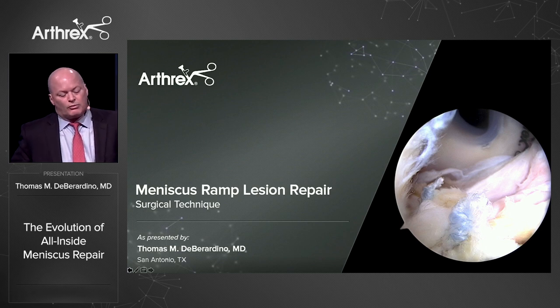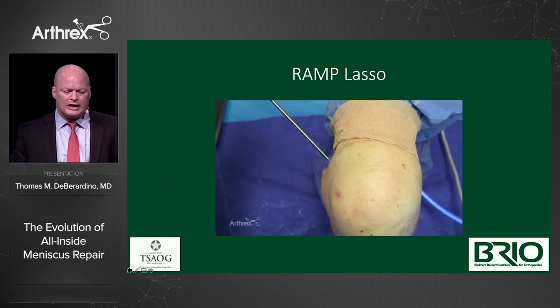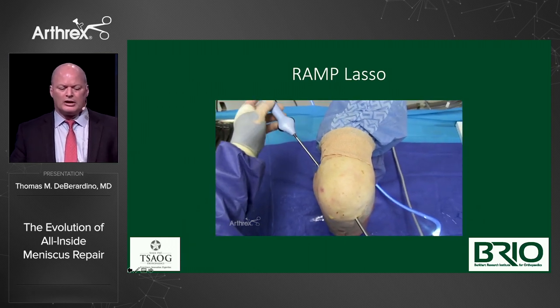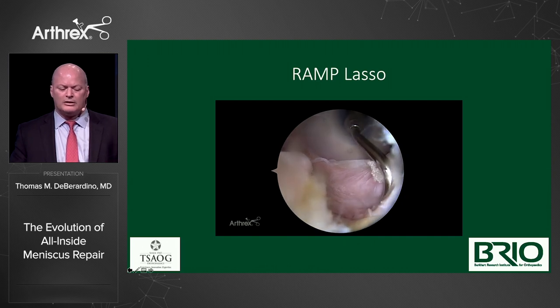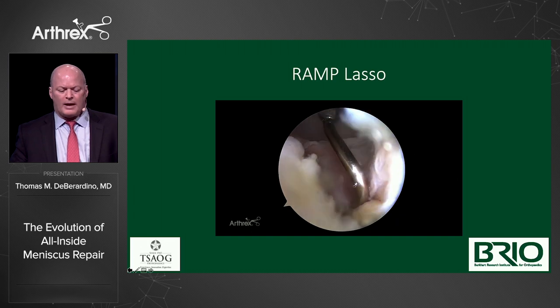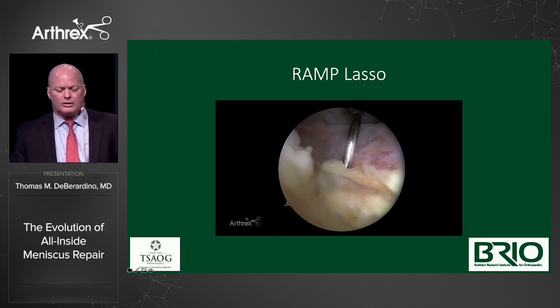For an all-inside meniscal ramp lesion repair, we have a passport in the back of the knee. Going through the semantics, we have the ramp lasso — it's angled just right so you don't shish-kebab the condyle but get a good bite in the posterior capsular piece. You want to bring the eyelet of the needle up into the crevasse between capsule and meniscus. We're getting our tuck of capsule in the back — just the capsule; you don't want to dig deep, there's stuff back there you don't want to poke.